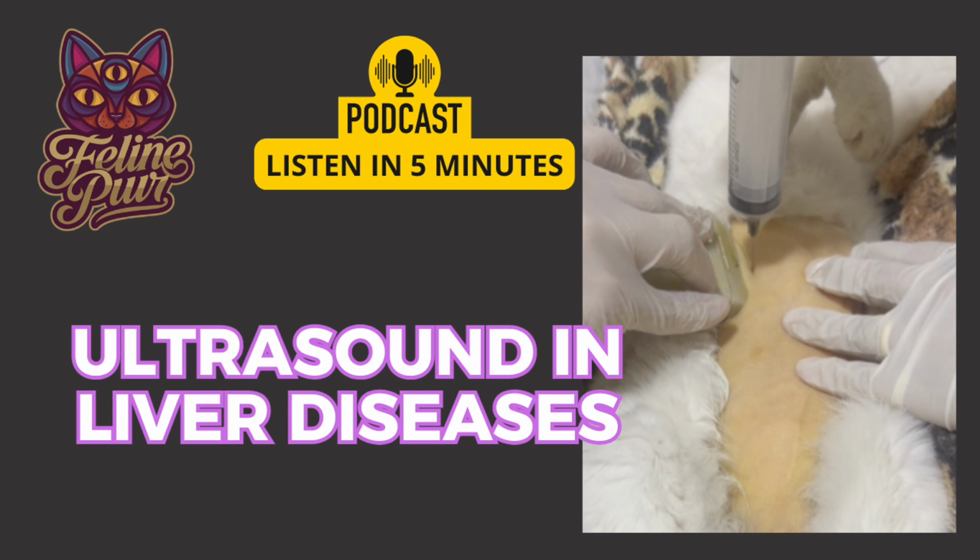It is important to remember that the ultrasonographic changes in the liver can be subjective and that some liver diseases may not show visible changes on the examination. Therefore, the interpretation of ultrasound findings should always be combined with the animal's clinical signs, laboratory test results, and, if necessary, biopsies or aspirates. Liver sampling, guided by ultrasound, aids in the diagnosis of lipidosis, lymphoma, and other diseases.